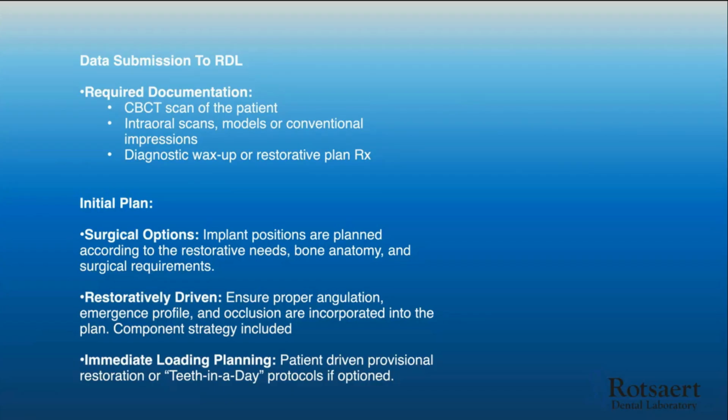And from immediate loading, for those of you that don't do the surgery all the time, when the doctors place an implant in, and I jokingly refer to IKEA furniture, when you work on different components of the furniture, there's different screw types, right? There's fine machine screws for certain things, and then there's screws for dense bone or dense wood, where they've got more rounded threads and they expand it to get better retention.